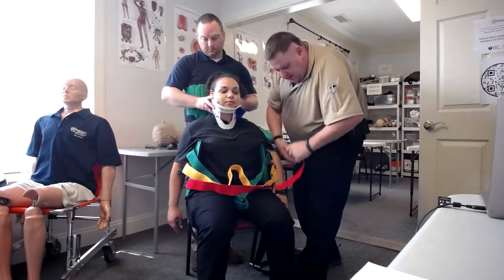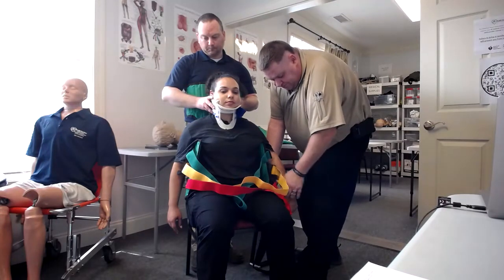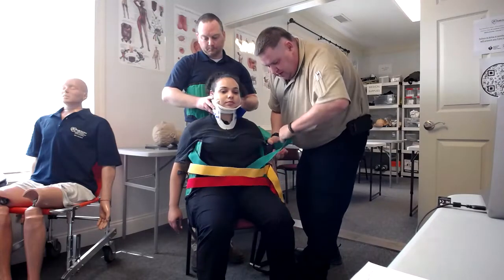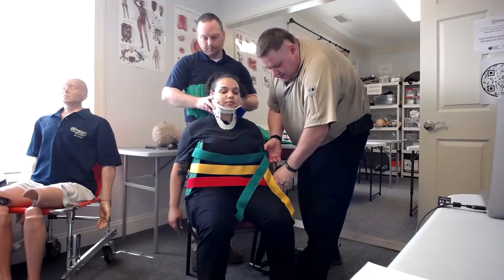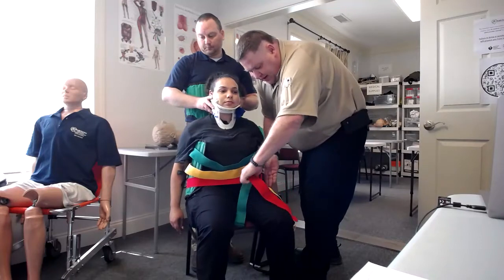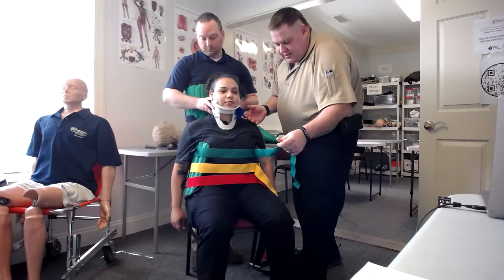Remember, every time you move the patient, ask if they've had any sensation change. If they're unconscious, check to see if there's been any changes in the patient. We now have these connected and we're going to tighten them up just a little bit so they're all where they're going to go. The main thing when you tighten these — do not over-tighten to where the patient is no longer breathing. Killing your patient in this process does not help. So we tighten, tighten, tighten. At this point, ask the patient: can you breathe all right? If they're conscious and can tell you, you do that.